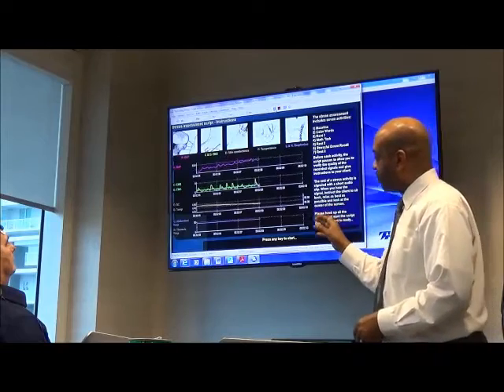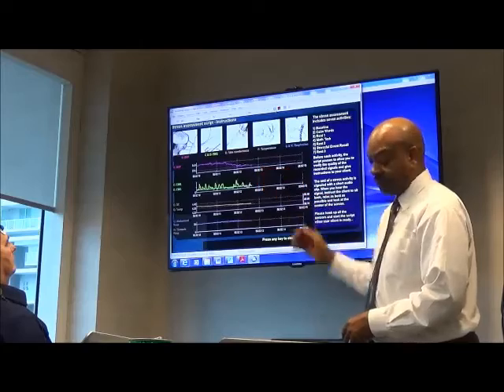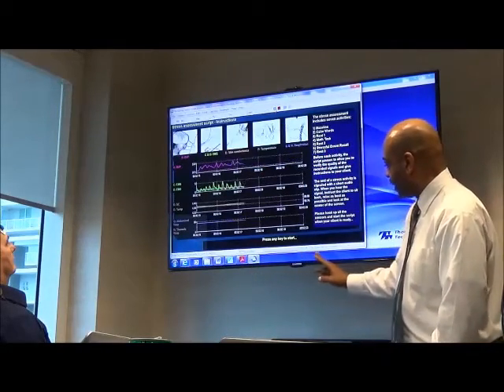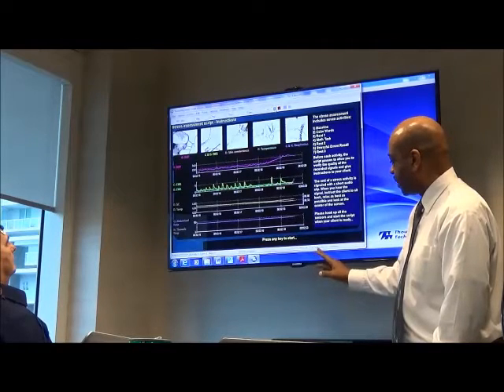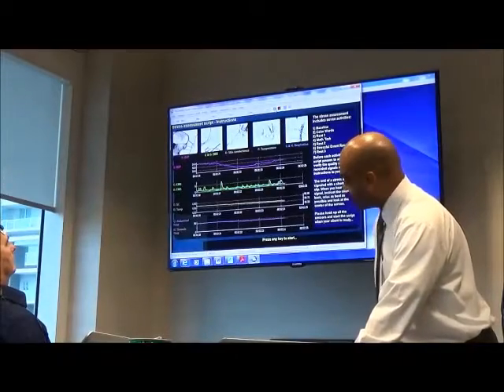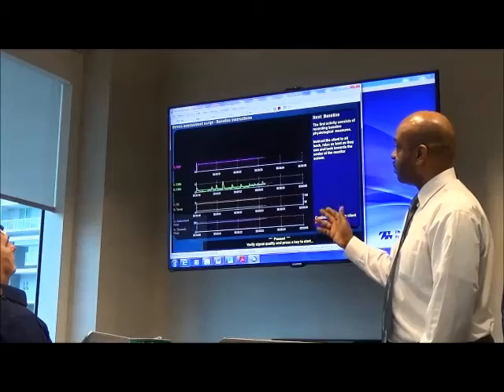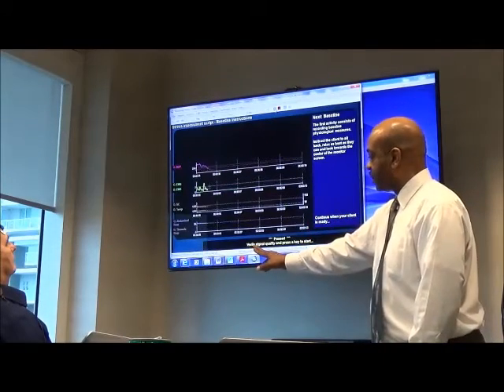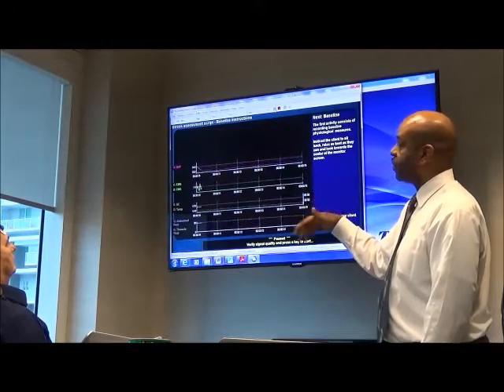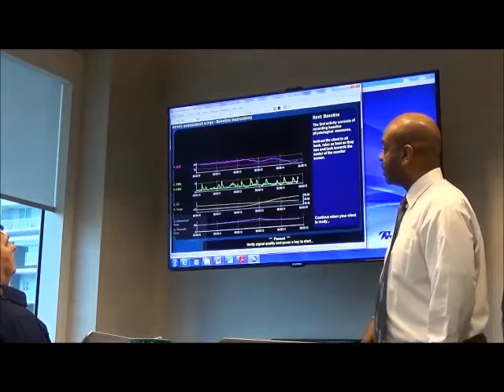So at this point, you have your instructions and you have the signals here. Now, at the bottom of the screen, it's saying press A to Z or spacebar to continue. So I usually just use the spacebar all the time. So I press that. Baseline. And it says baseline, but on the bottom of the screen it also says verify signal quality and press the key to start. So what you want to do before you actually start going through the whole thing is look at your signals and see if they look okay.